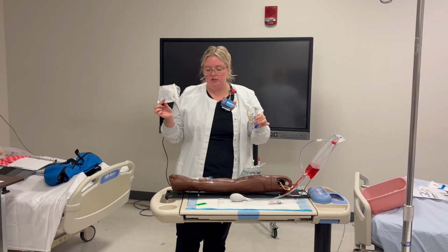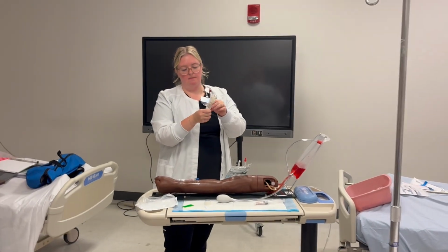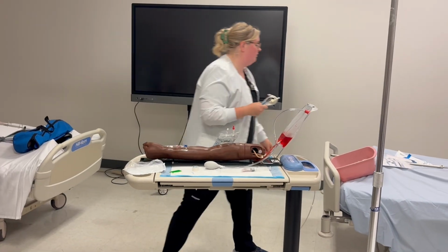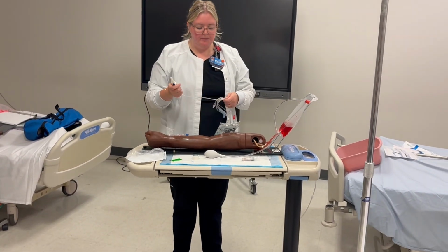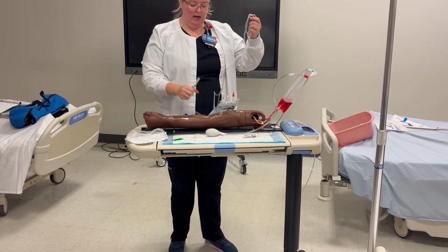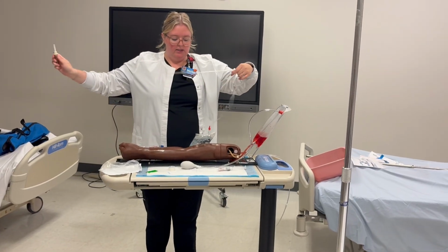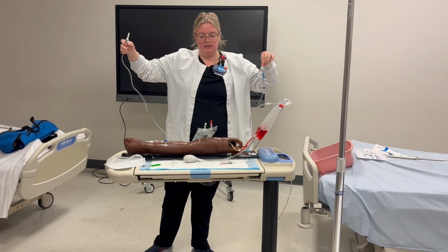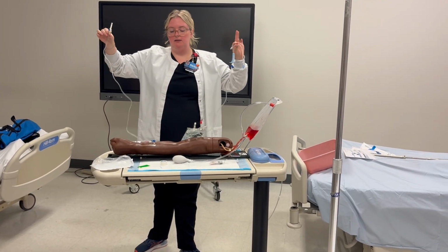So the first time you use it, you want to keep this bag. The first time you use it, it's going to come with this little white guy on there. We're going to take him off. This just becomes trash. You can't reuse this. Okay. So we're going to spike the bag, okay? Why are we spiking the bag and doing all of this before it's hooked up to the patient, do you guys think? To remove the air. Yes, this is full of air. We cannot give this to our patient.